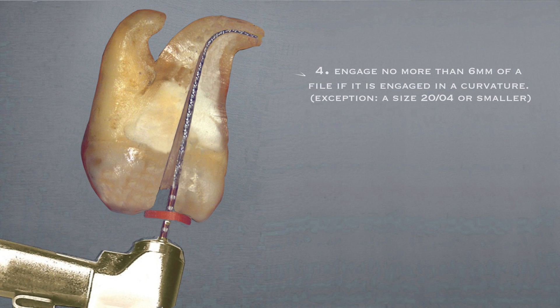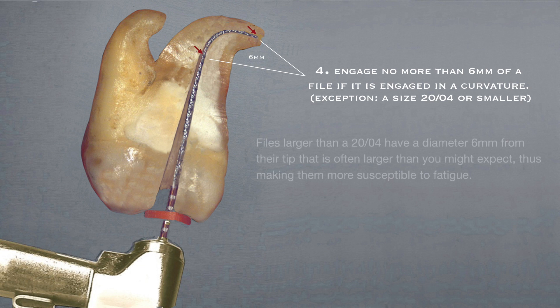Let's take a closer look at the first new principle, number four. Engage no more than six millimeters of a file if it's engaged in a curvature. Files larger than a 2004 have a diameter six millimeters from their tip that is often larger than you might expect, thus making them more susceptible to fatigue.